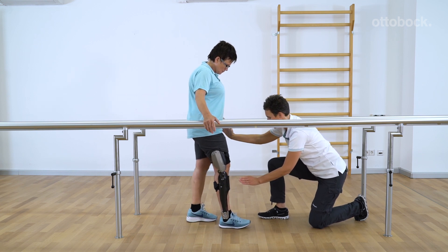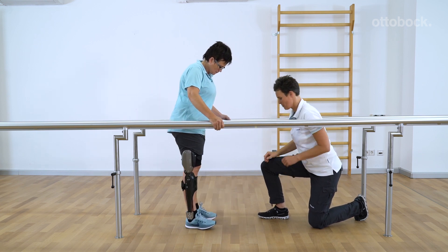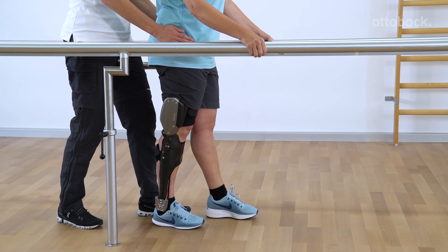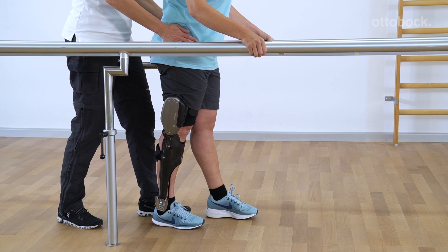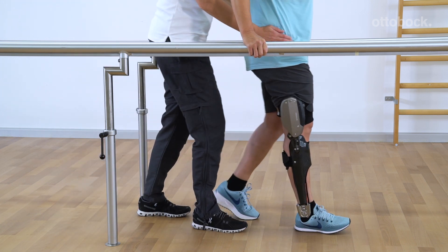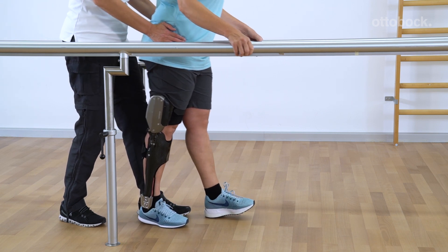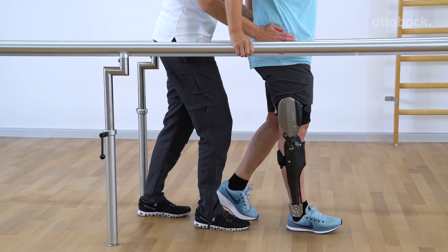Once the patient has gained sufficient confidence to put weight on the leg with the orthosis during knee flexion, the first steps can be practiced. The therapist makes sure that the stride length is consistent, the gait width is appropriate, and that circumduction and lifting of the hip are avoided.